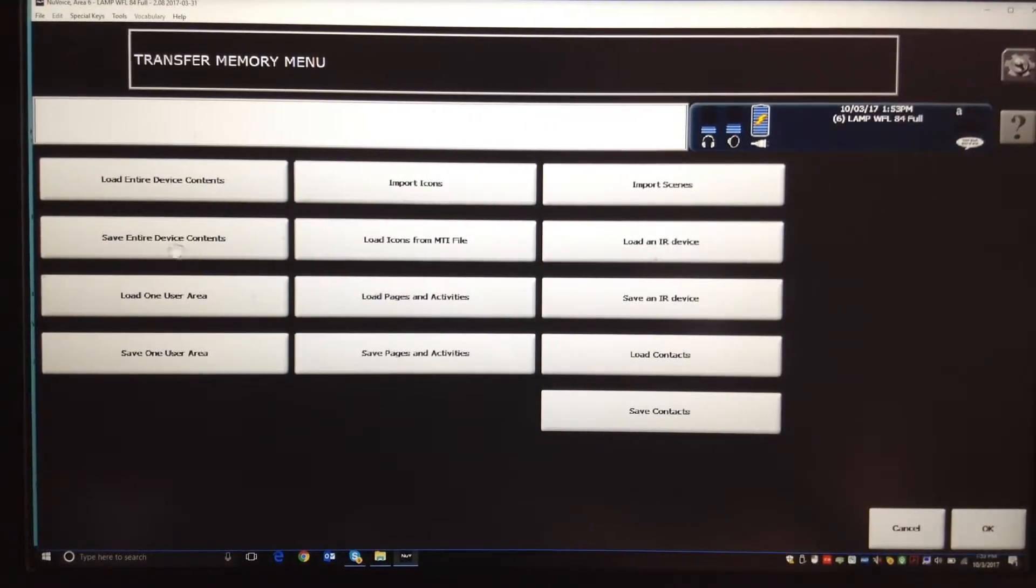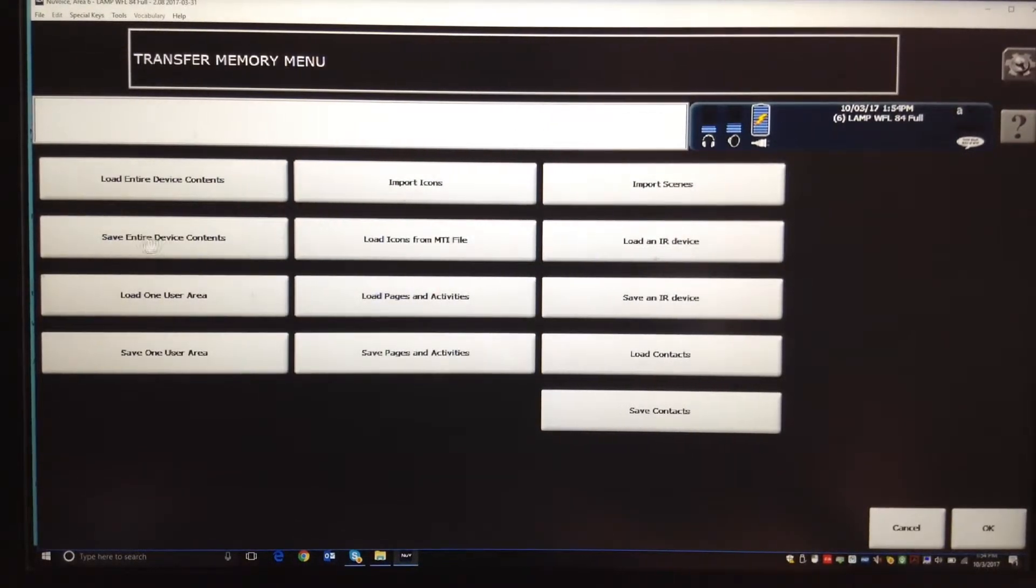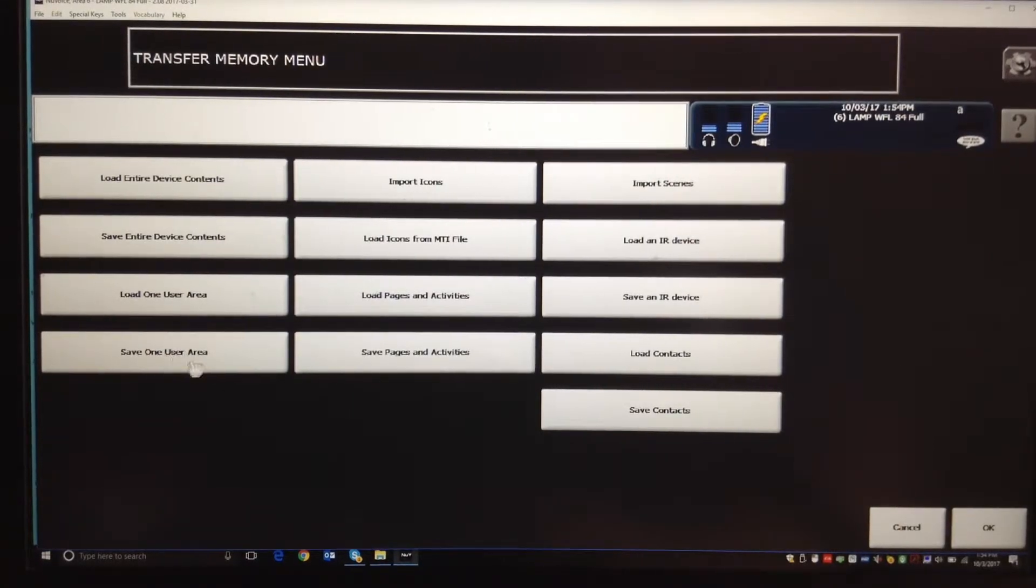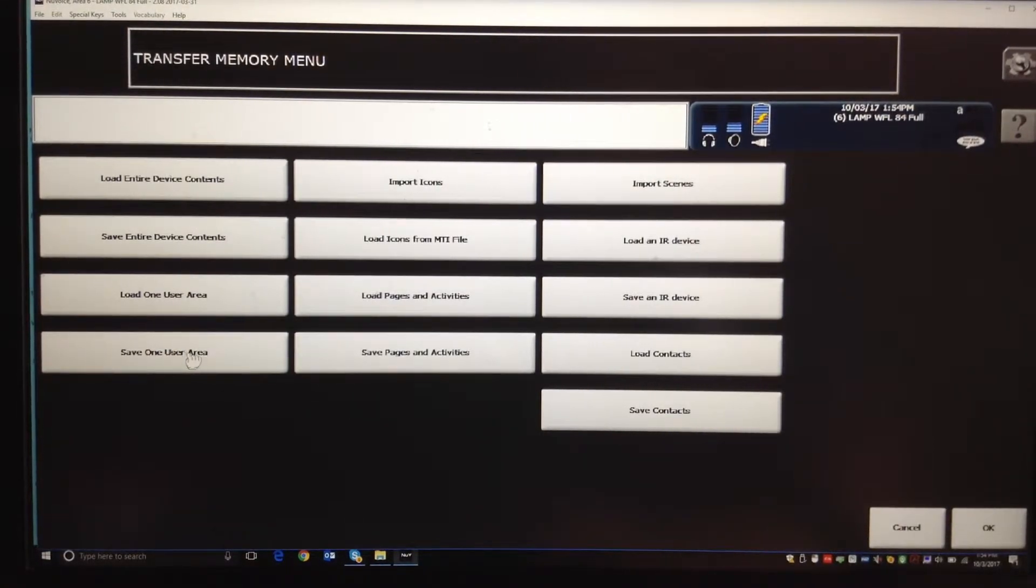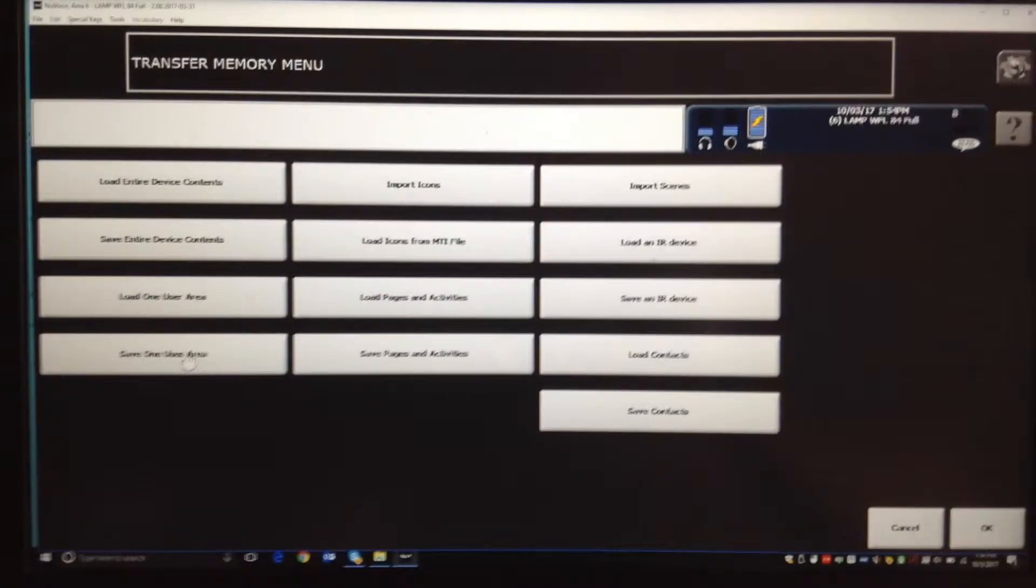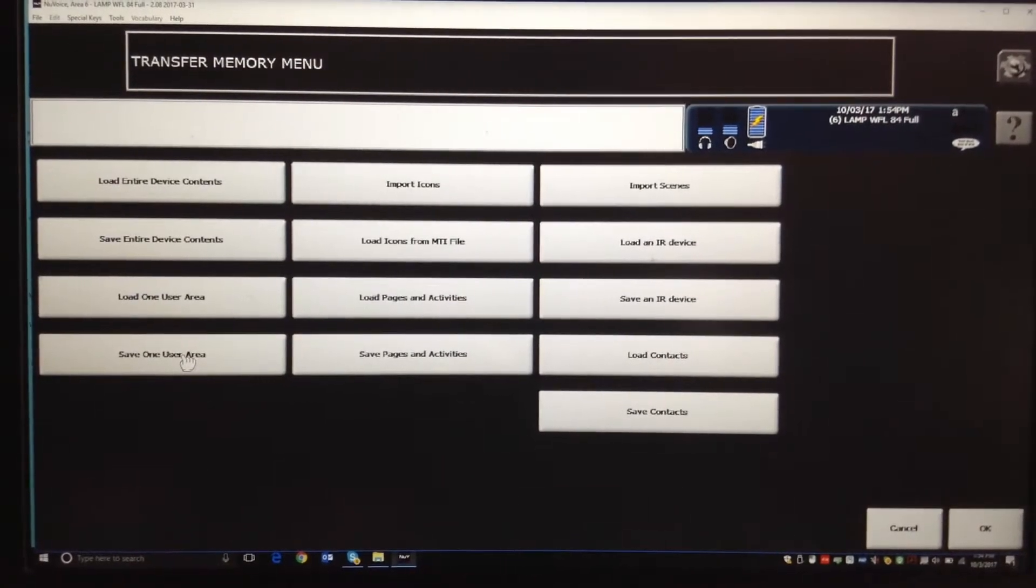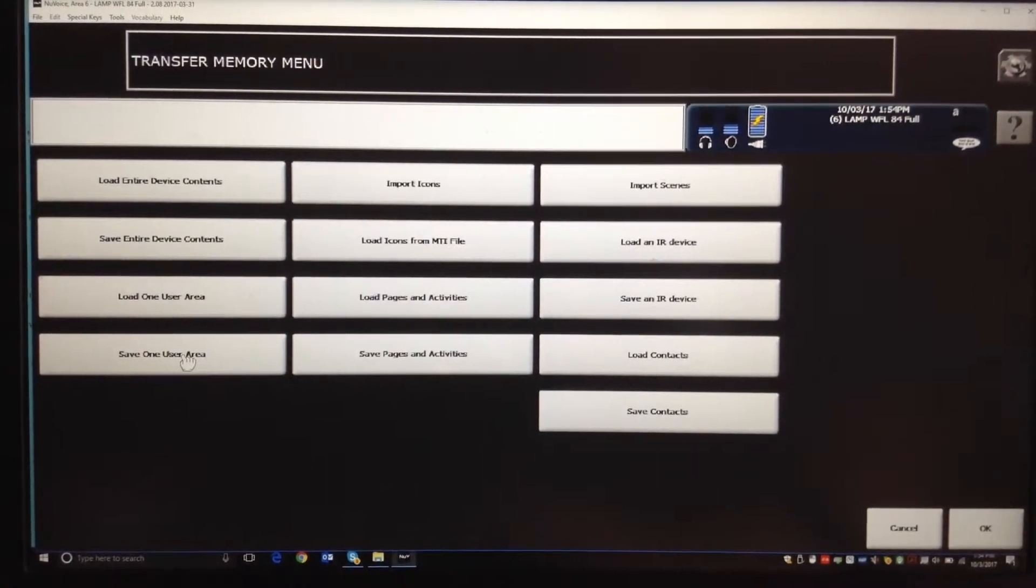So if you wanted to save the entire device, you'd do it here. If you want to save one user area, you'd do it here. Now remember, you're on their device, the one they're using.